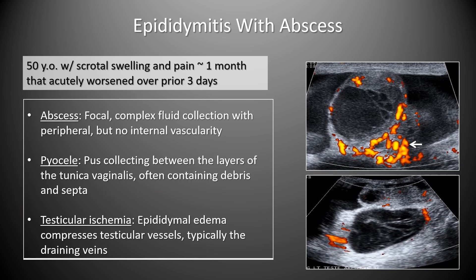A 50-year-old with scrotal swelling and pain for a month that acutely worsened showed a complex collection with an enlarged epididymal head containing internal septa and low-level echoes consistent with debris. There was surrounding hyperemia and complex fluid with internal echoes surrounding the epididymis — epididymitis progressed to abscess, seen as a focal complex fluid collection with peripheral but no internal vascularity. Complications include pyocele — pus between the layers of the tunica vaginalis — and testicular ischemia from epididymal edema compressing testicular veins.